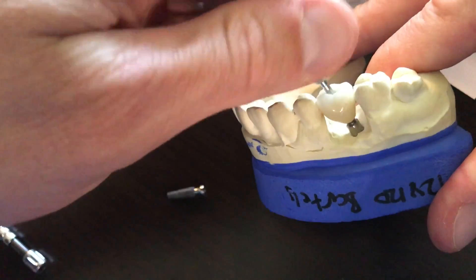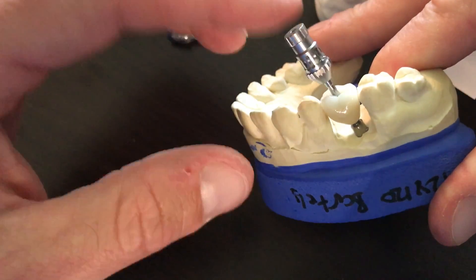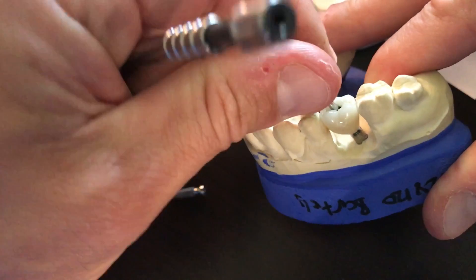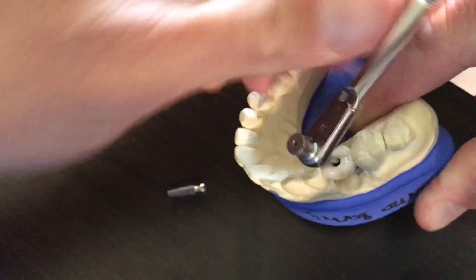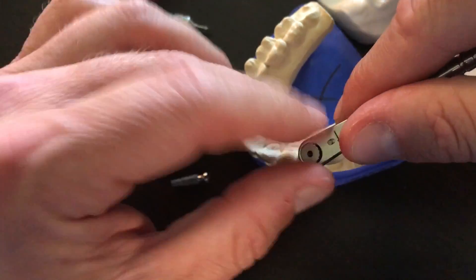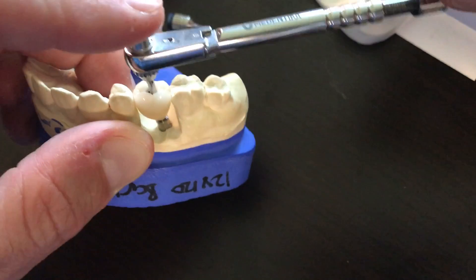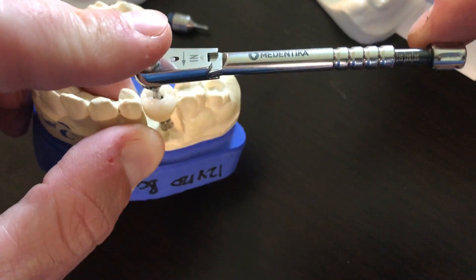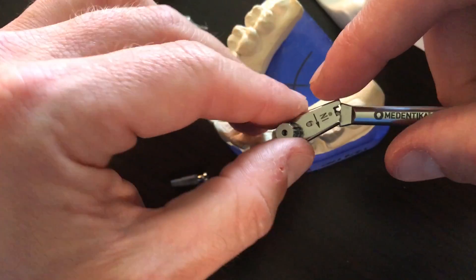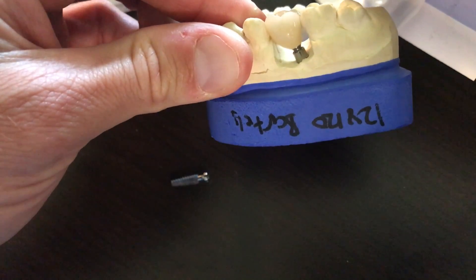When we do that, coming back from the laboratory — probably two weeks later — we insert this. Using the 035 screwdriver, also called a 0.9, we would simply turn this just until it gets tight because we're only going with this connection to 15 newton centimeters. We're set at 15 newton centimeters on our torque wrench. And boom — that's all I need is that 15 newton centimeters to torque that lovely screw-retained single unit crown down and seated.